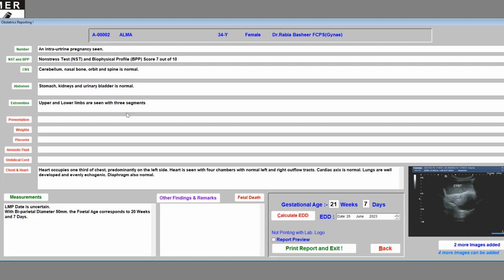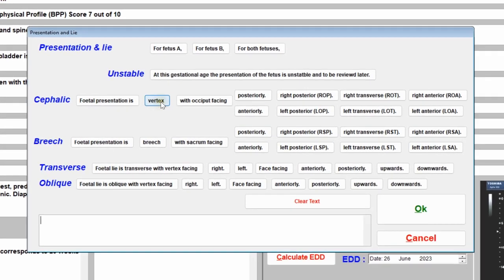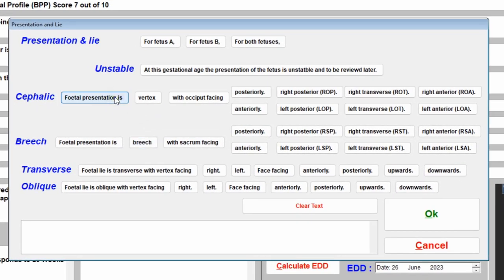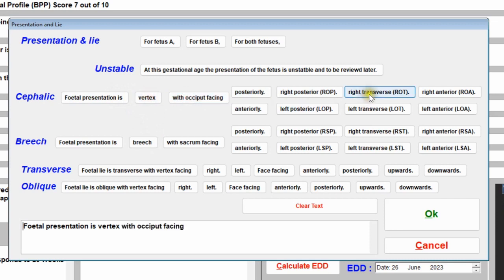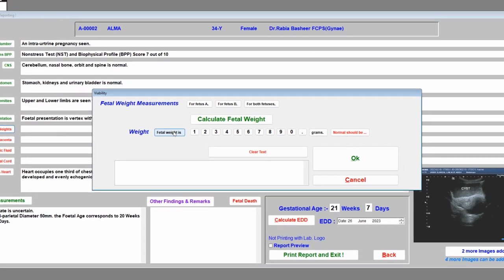Click 'Presentation'. Suppose the fetal presentation is vertex with the occiput facing right — click 'Right Occiput Transverse', then click OK and it will update with what you have selected. Now comes the fetal weight section.